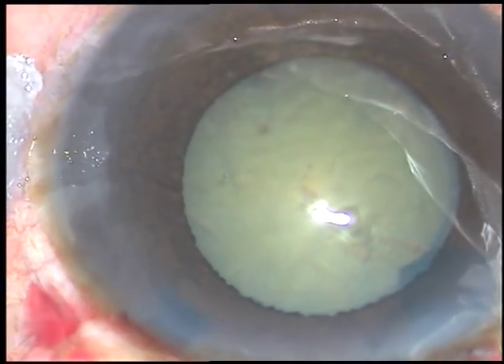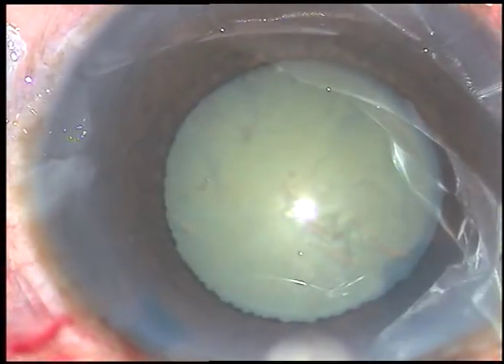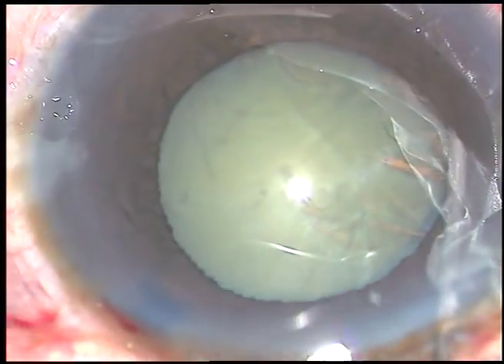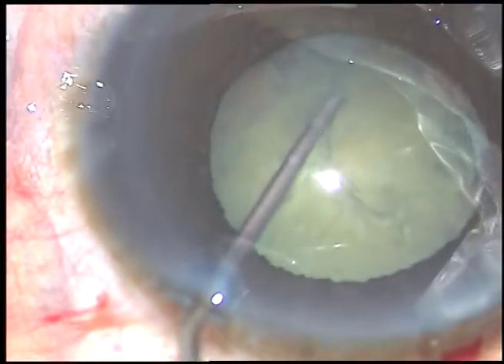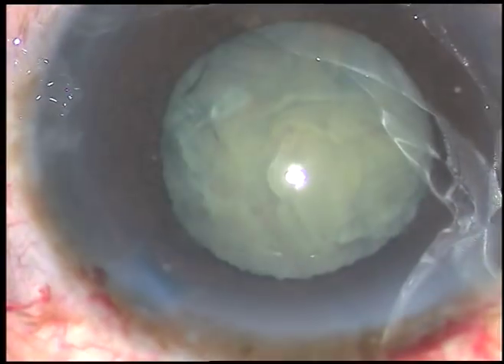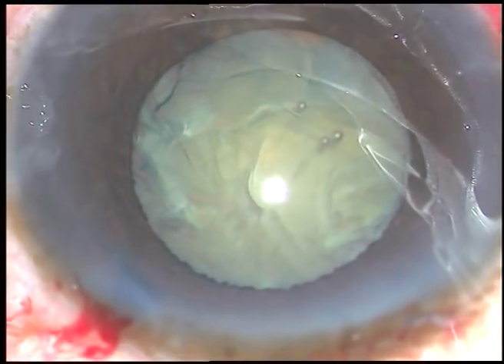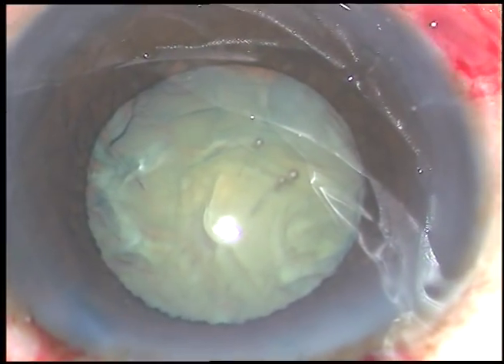And thus I have been able to do an adequately sized rhexis. Now these are the steps which we must take a lot of care with. Hydrodissection should be very gentle — a little amount of fluid has to be injected. The nucleus has to be tapped and rotated gently. In this case, the nucleus rotates freely.